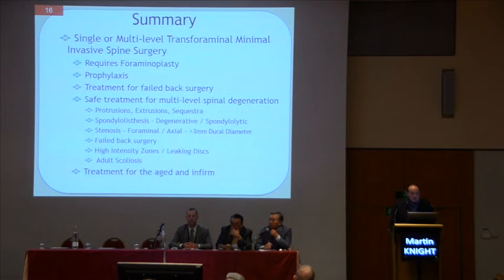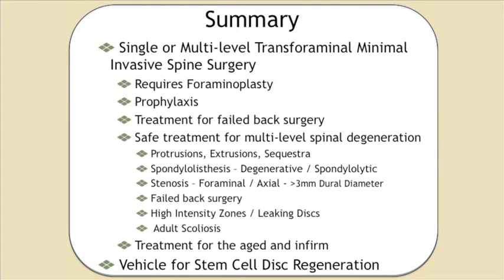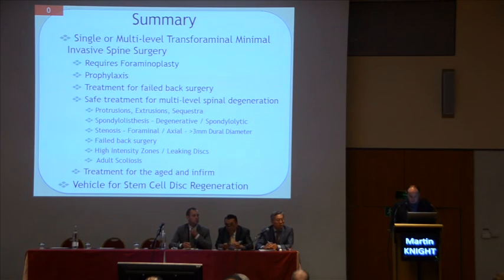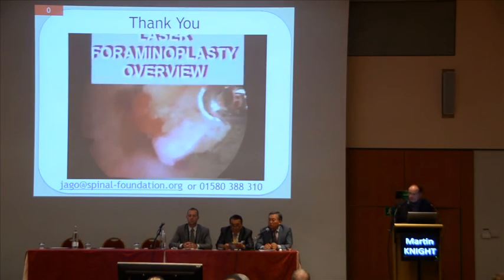So in summary, single and multi-level foraminal decompression, foraminoplasty, really centers on the philosophy of prophylaxis. It's excellent for the treatment of failed back surgery. It can treat a wide spectrum of degenerative pathology in the spine, and particularly in the aged and infirm. And I think that you'll find shortly that it's going to become a very good vehicle for stem cell disc regeneration. Thank you very much.